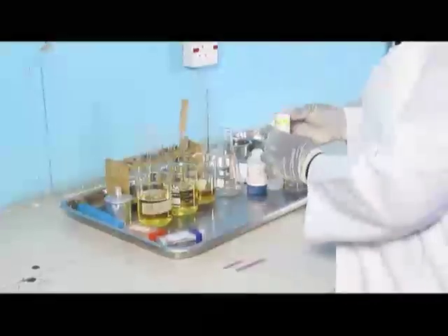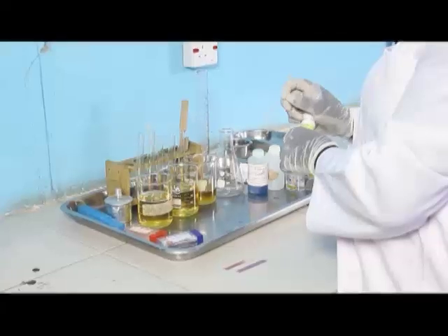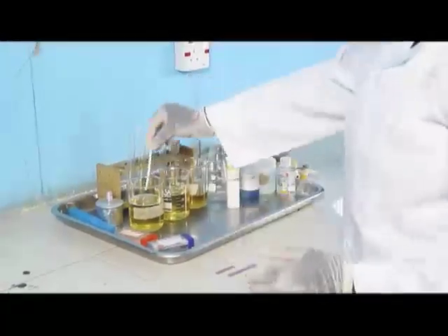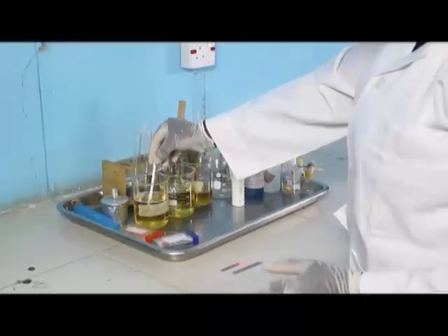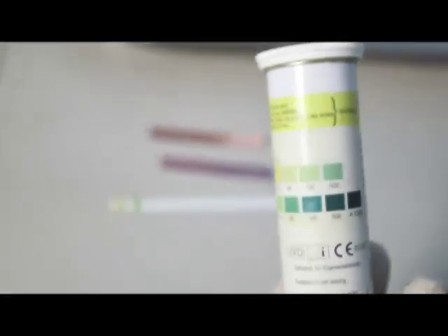Procedure performance. To test for glucose in urine, one test includes the use of Clinistix. The test end of the Clinistix strip is dipped in the urine, removed and placed on the slide. At the end of 1 minute, both sides of the paper are observed. A change in color from the original color indicates a positive reaction. Blue color is a positive result as you compare with the chart.